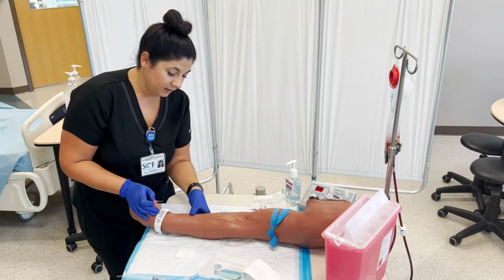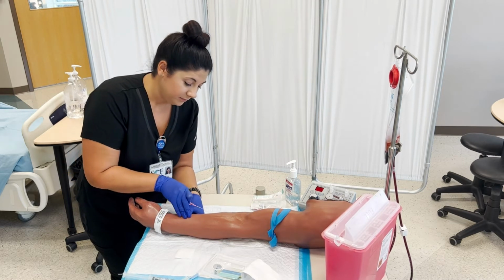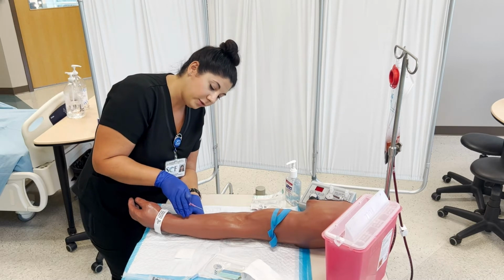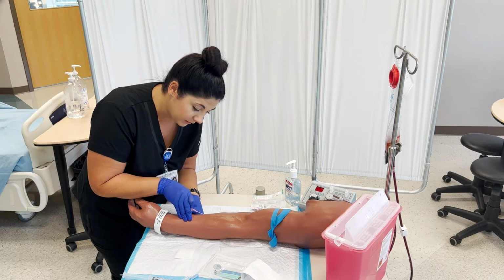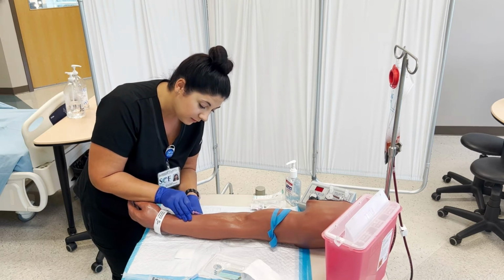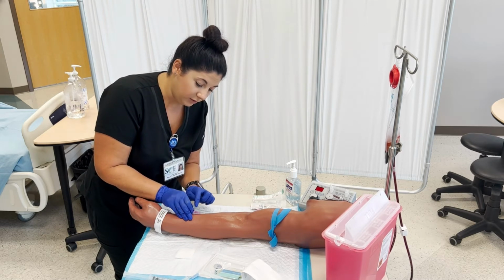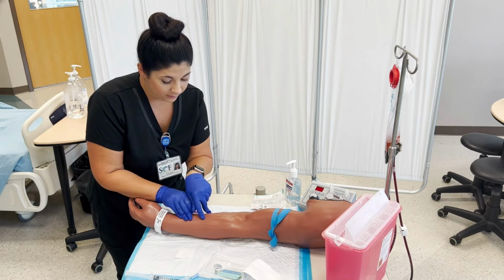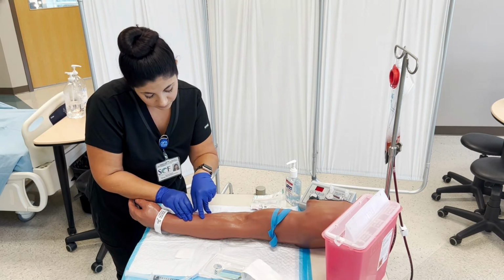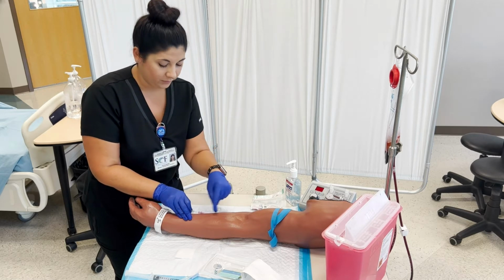Then go ahead and use your non-dominant thumb to pull down the skin taut, and going at about a 30-degree angle, you go straight in following the line of the vein until you get a little blood return right here. And then you want to drop the angle and push it up just a tiny bit. And then I like to stabilize my fingers here and use my thumb to push this forward. Some people like to use their finger. You'll figure out what works for you.